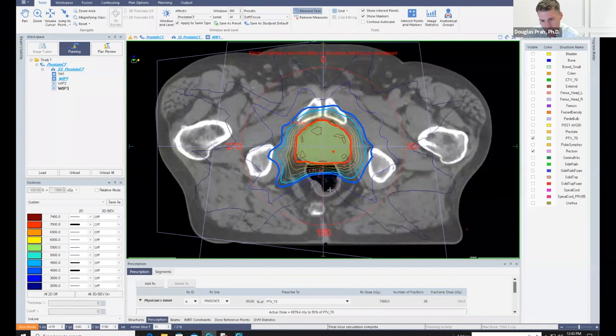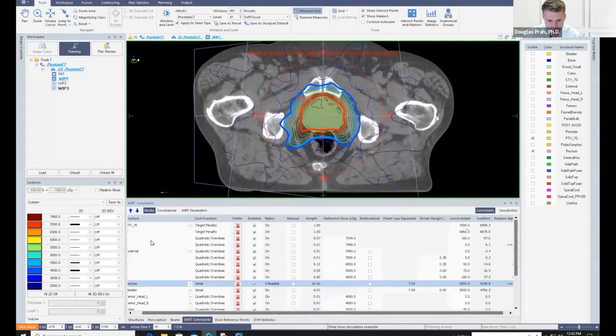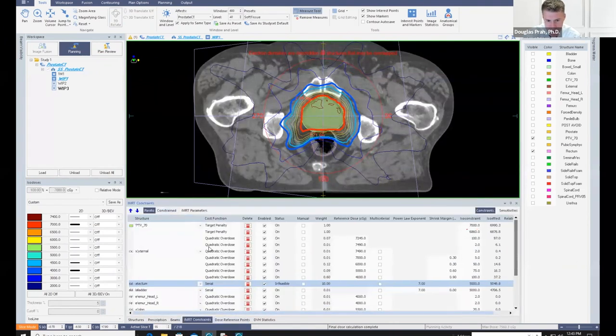So that's one thing. I always think of isodose lines like a balloon. If you push really hard here, the dose comes out somewhere else. So you put pressure here, your other isodose lines have to extend out a little further. So the more constrained your plan is in certain areas, the more you probably need to reevaluate your constraints, the external contour constraints that you're using to control dose gradient here.